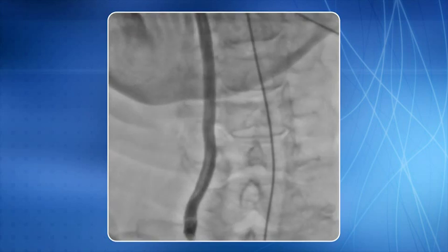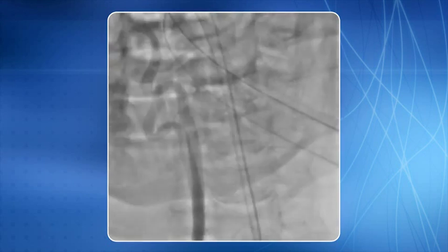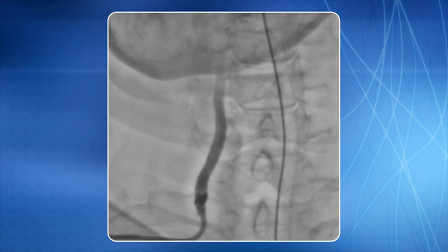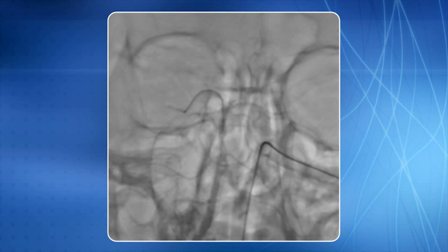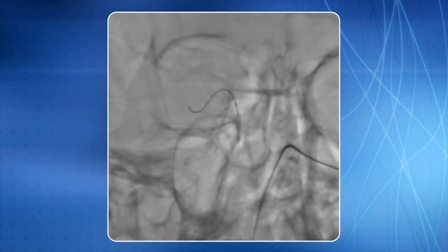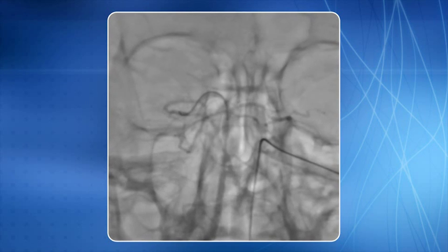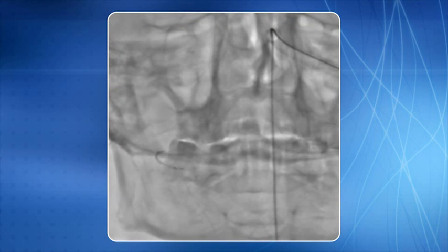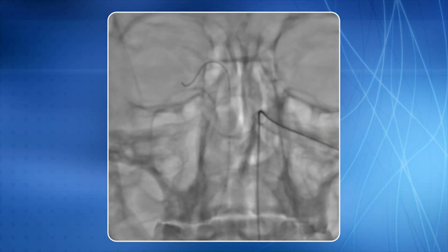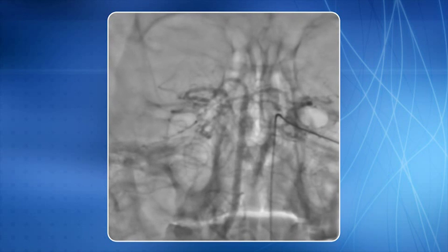Now I will show the case of stenting of chronic basilar artery stenosis using the right transradial approach. The right vertebral artery is cannulated using a 6F JR4 guide catheter and the lesion is profiled. A 0.014 inch BMW PTCA guide wire is negotiated across the lesion. Ballooning is done using a 2.5 millimeter PTCA catheter. A balloon expandable stent is then negotiated and kept across the lesion. Stenting is in progress and this is a satisfactory end result.